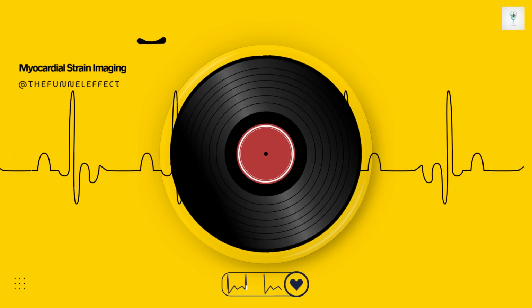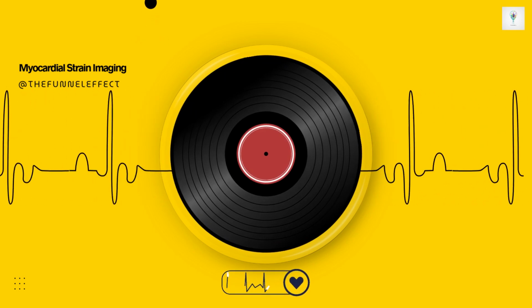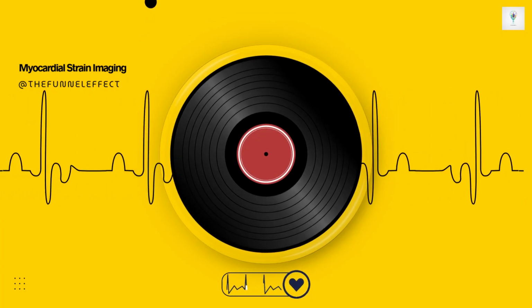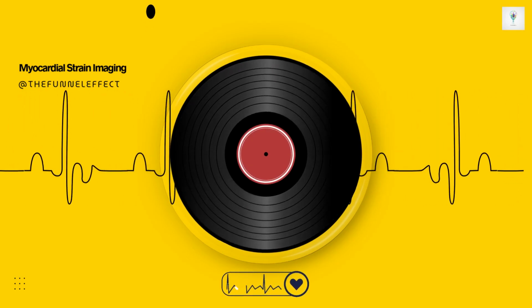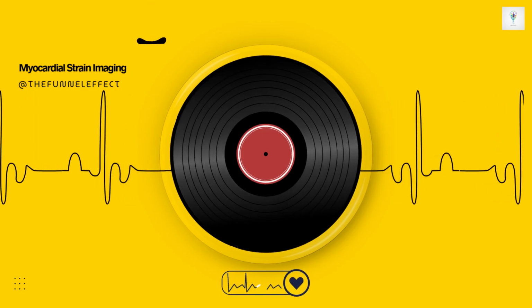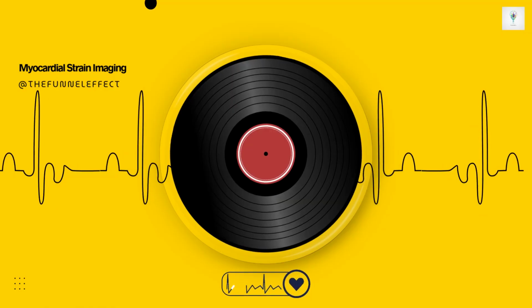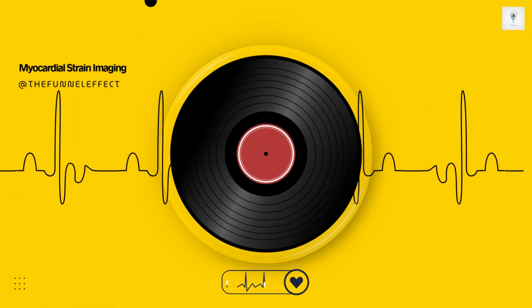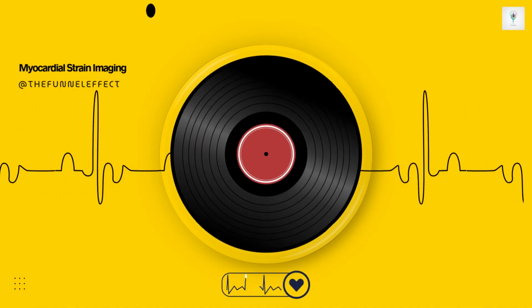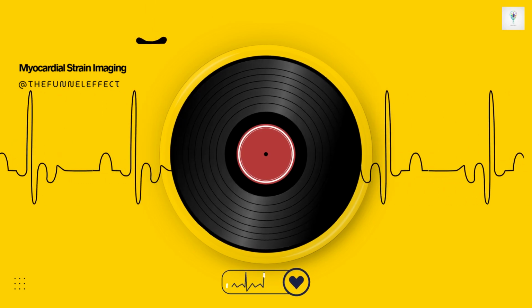Right. Exactly. The EF can be deceptively high, creating this illusion of normal or even hyperdynamic function, while the underlying muscle mechanics are actually severely impaired. GLS cuts through that illusion because GLS measures the tissue deformation directly. A reduced GLS in these hypertrophied hearts confirms that systolic impairment is definitely present, regardless of what the EF number says. This is why strain is often a key diagnostic feature, for instance, in differentiating amyloidosis. Okay, those three mechanisms really clarify why GLS is superior.